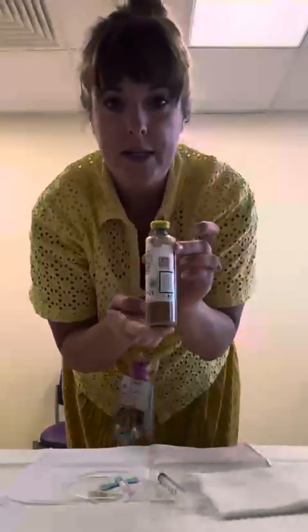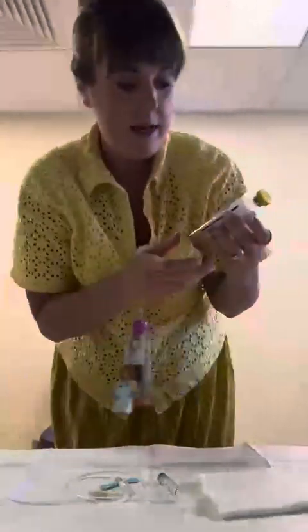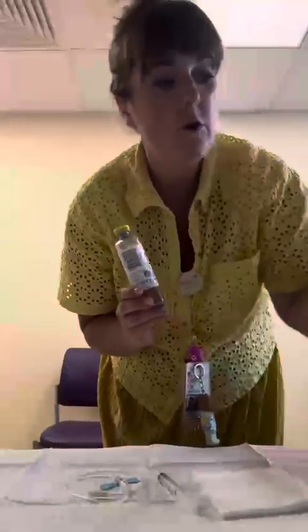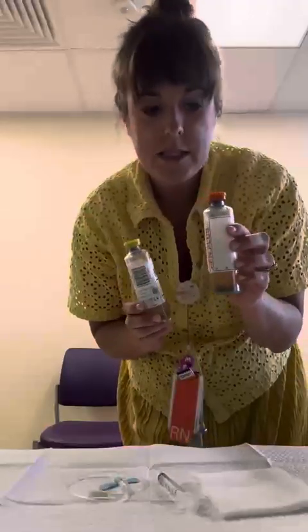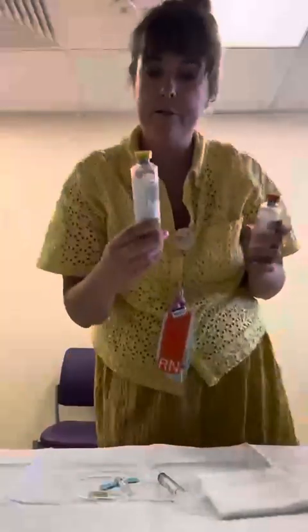So blood cultures, we're seeing what kind of bacterial growth. You've got 2 options. This is our PEDS aerobic bottle. It's yellow, just like me. I didn't plan that, but this is perfect for today. And then we've got an anaerobic bottle. If they're concerned about some sort of GI gram-negative kind of bacteria, they might also order this, but the yellow is going to be your go-to. Just remember my little sunshiny outfit.